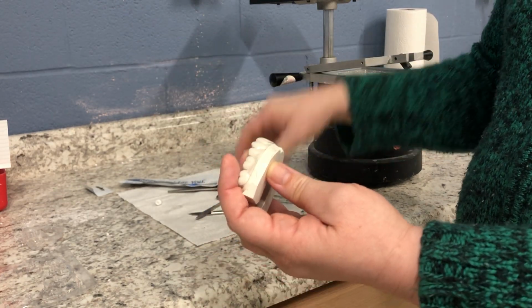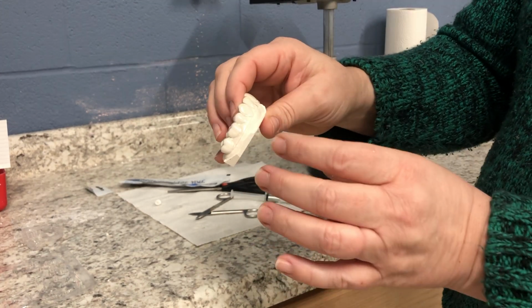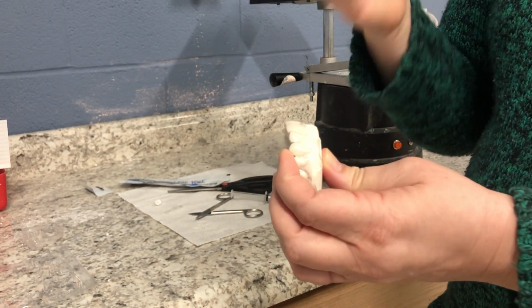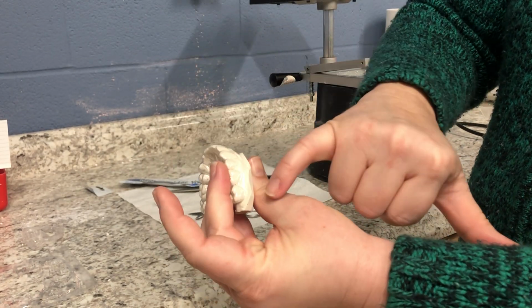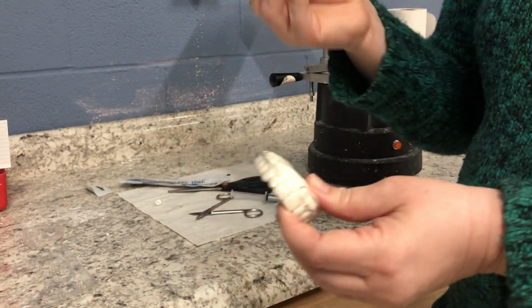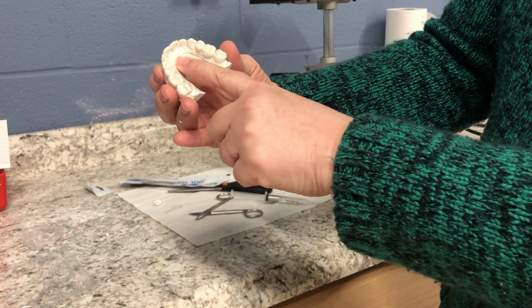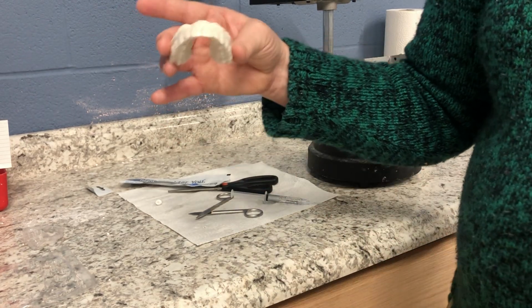Then you can press on each tooth while it's in your mouth, and it just seeps down into the interproximal areas. And that's where those whitening strips really don't do the same job as a bleaching tray. So you want to get into the interproximal so there's no yellow left and it looks like you have something between your teeth. So nice and pressed here, and nothing has dripped over into the gums, and that's why I like to use that amount. So there's our bleaching tray, and you can see here it'll still be comfortable because they can feel their own palate, so it makes it nice to be able to sleep in it.